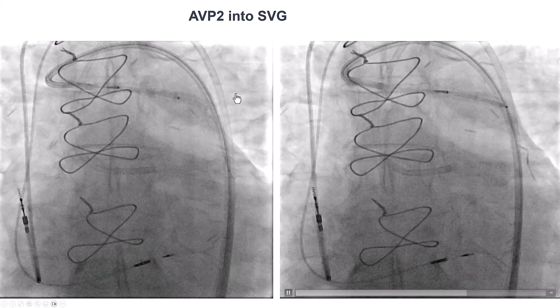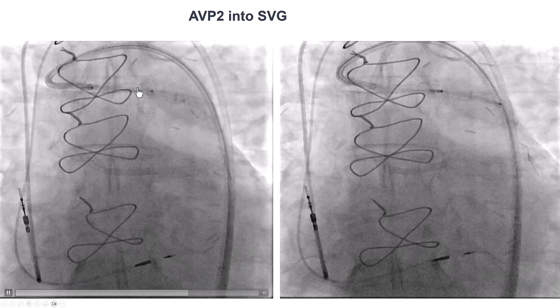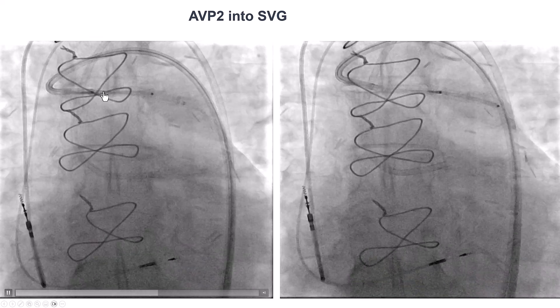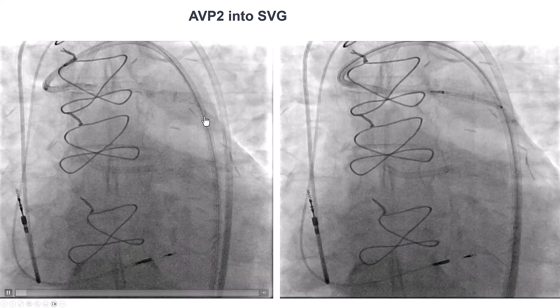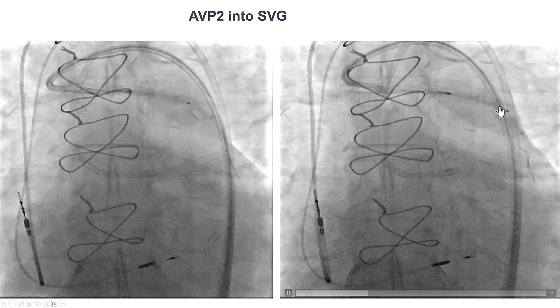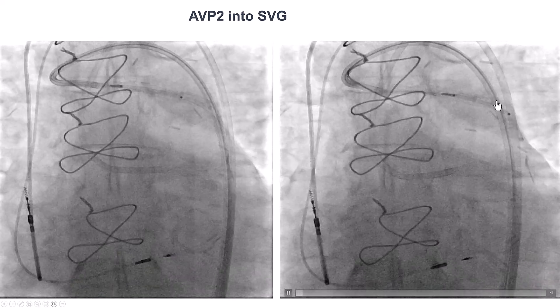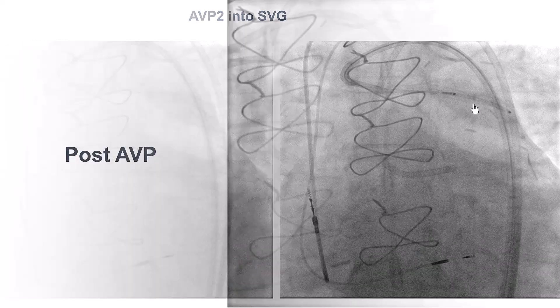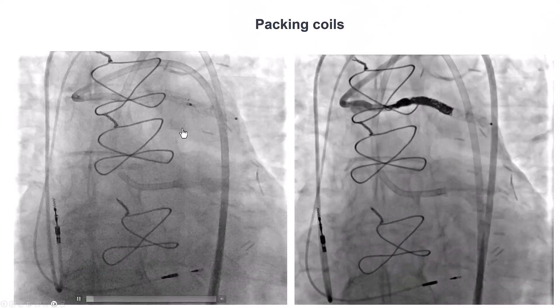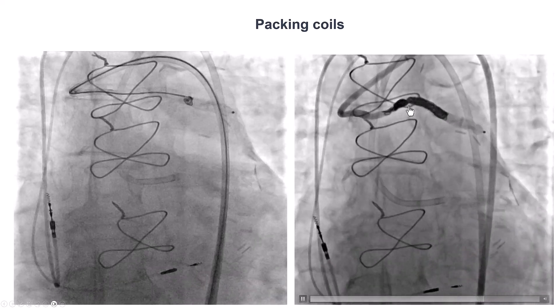We then decided to close the graft because we had ballooned it and now had significant flow. There are two ways to close the graft. One is to use an Amplatzer vascular plug, which is what we tried here. The Amplatzer plug is loaded inside a guide extension, which is advanced to the target part of the vein graft. Then we unsheathe by pulling back the guide extension, allowing the plug to expand. There was still quite a bit of flow in the saphenous vein graft, so we ended up using a Penumbra packing coil that successfully occluded the saphenous vein graft.